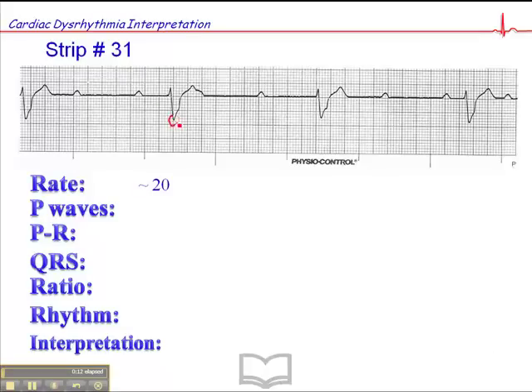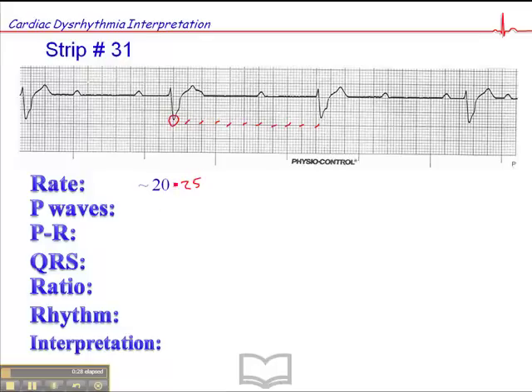This is one that falls on a dark line: 300, 150, 100, 75, 60, 50, 43, 37, 33, 30. You might argue that that's 25 or 26 or so — we'll give it 25.